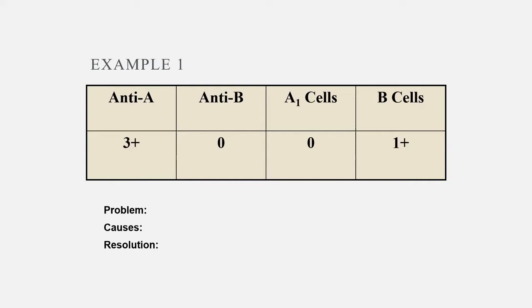So if you incubate 15 minutes at room temp and it goes up to 2+, you could keep going and incubate 15 minutes at 4 degrees. That might bring it up to 3+. It's not like we really want to go crazy on this because you have a cause for the discrepancy. But usually the first time you see a patient, you want to do as much as you can on the investigation to make sure you're confident in whatever you're saying.